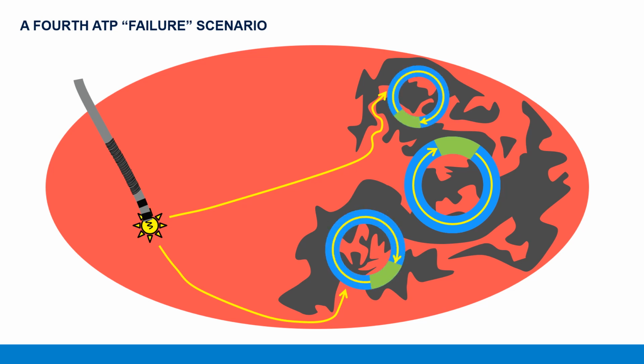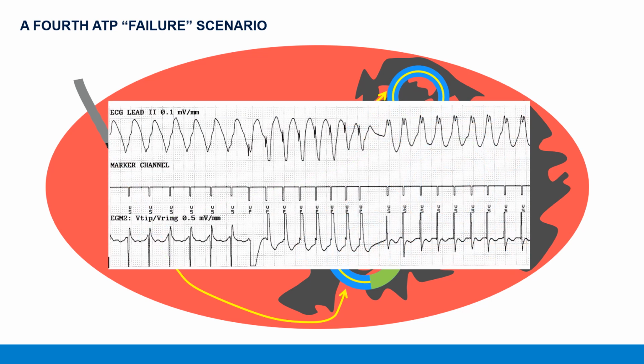If this occurs, then the algorithm will need to start over again because we have a new tachycardia cycle length, and the IATP algorithm will have to recalculate the number of S1s and the S2 cycle length, and then it will start from scratch with this new VT. Here's an example of that occurring with a traditional ramp ATP algorithm, where we have VT1 here on the left.